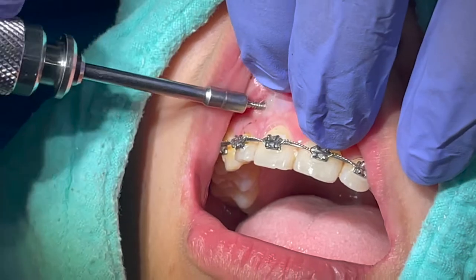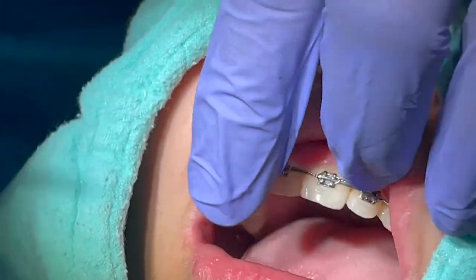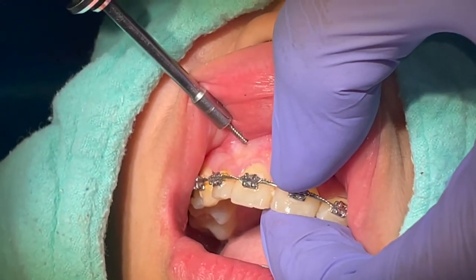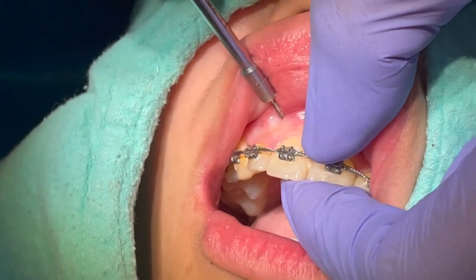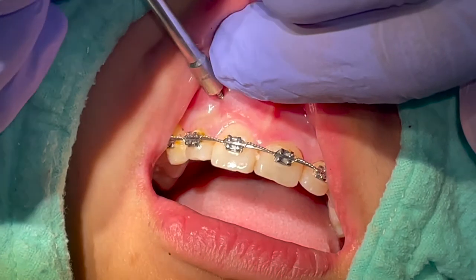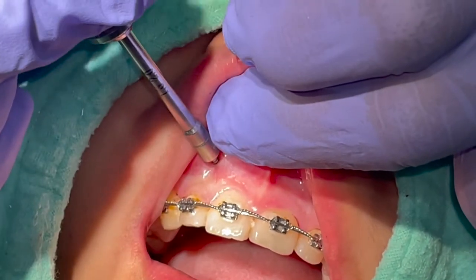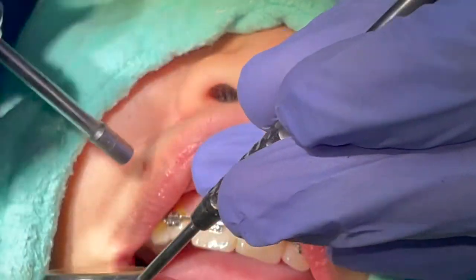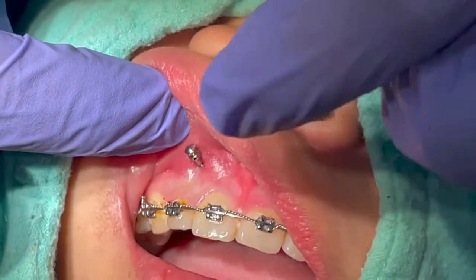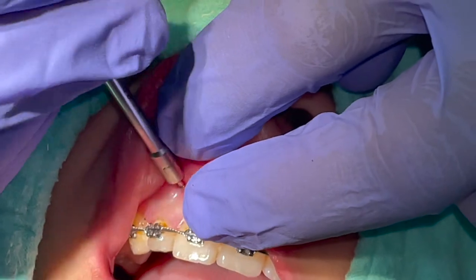This video is about my technique for anterior intrusion to correct a deep bite. A lot of orthodontic practitioners are apprehensive and hesitant about incorporating the use of TADs in their orthodontic practice. But what I can say is that TADs are perfectly safe as long as you understand the anatomy of the insertion site. True mistakes can be made, but if you prepared well then it should not be a problem. I hope that this short clip can inspire those who are still hesitant to use TADs.